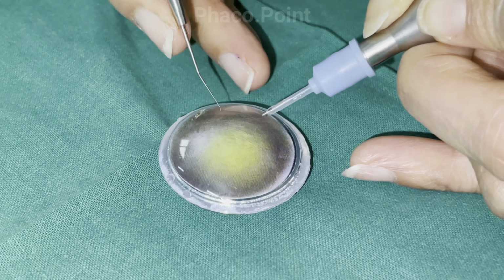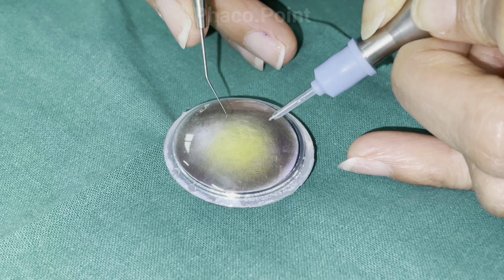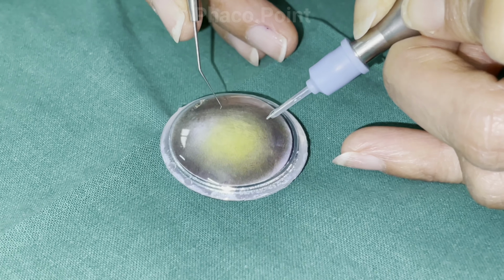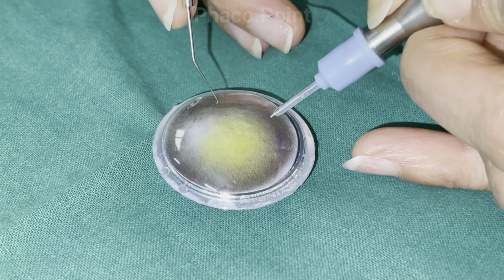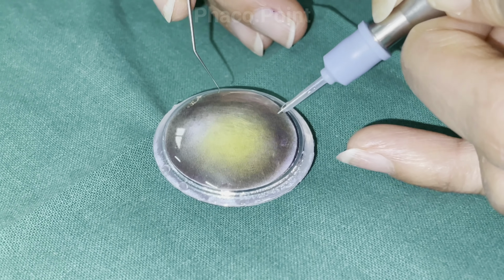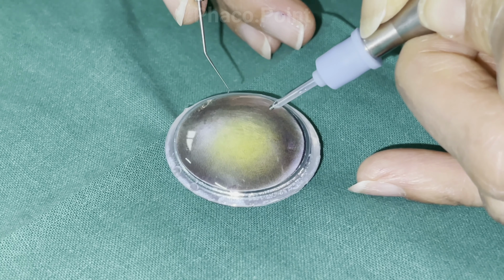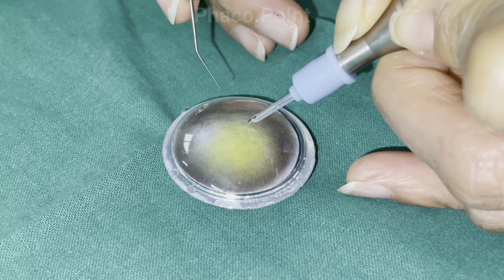Your second instrument, which is your chopper, goes into the eye. And now what would be your foot pedal control while performing the chop? Still in 1, then move to foot pedal 2, then move to foot pedal 3. Only and only when you get to foot pedal 3, you start impaling the nucleus. You impale, get to the depth you want in foot pedal 3.